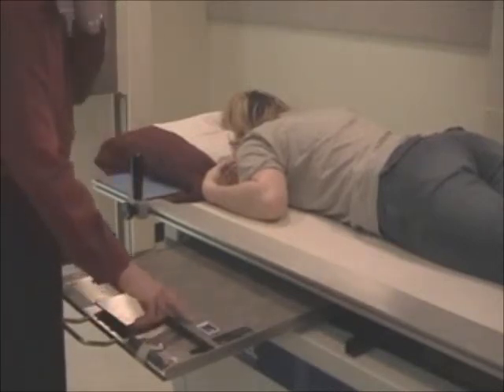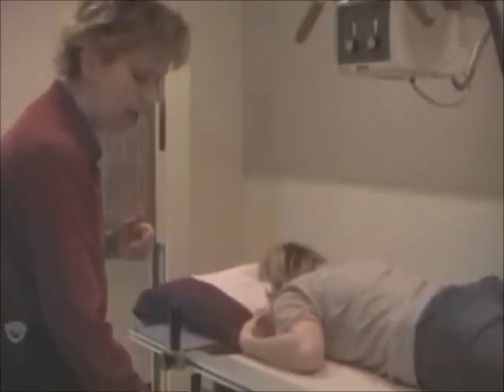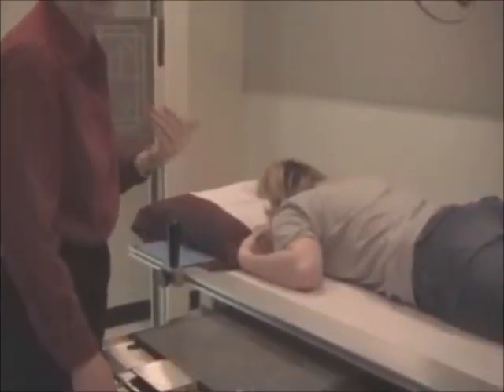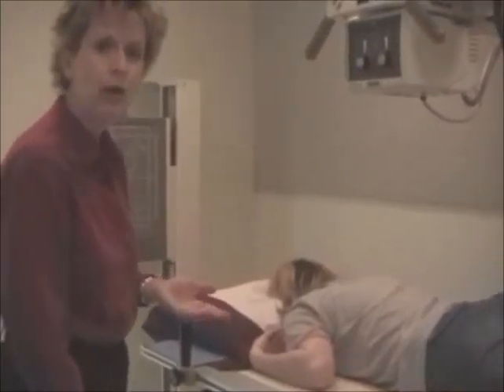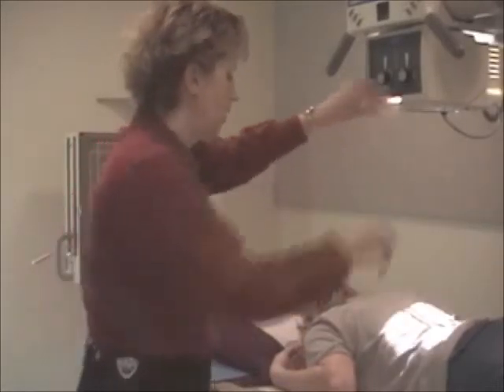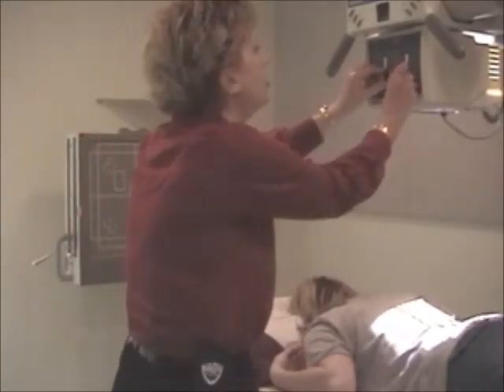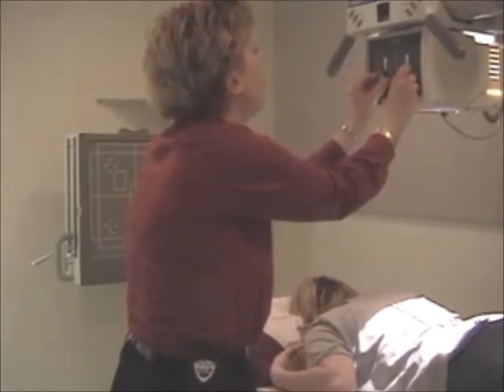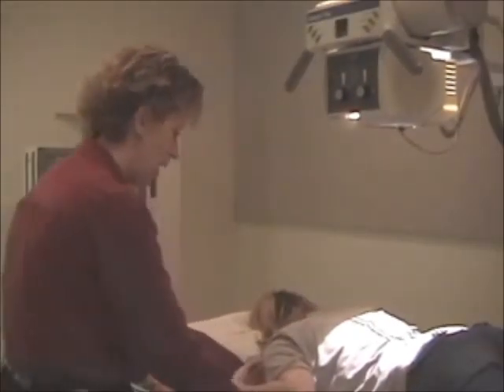In the lab here we don't have those markers, but in the hospitals you will. So a 15-minute marker here might be a half an hour, could be 45 minutes, could be an hour. Whatever the time frame was, that's what you'll put on your cassette. And collimation is 17/14. And if the patient allows, you can come in tighter.